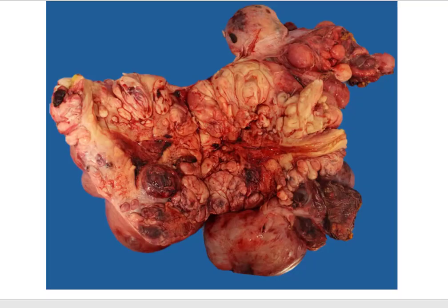Okay, then what we have in microscopy. Moreover, in the radiology report, it was stated that the mass was supplied by the gonadal vein, artery and internal iliac artery, and has dense collaterals. In the lung parenchyma, there are multiple 1 centimeter nodules, which are very suspicious for metastasis. To facilitate surgery, the mass was embolized.